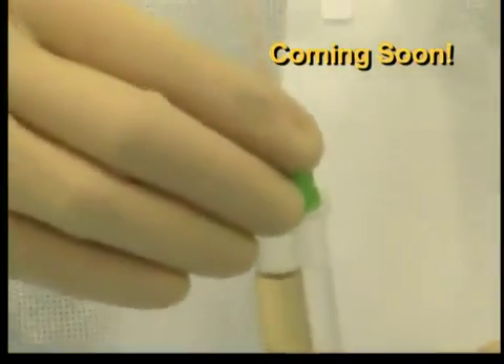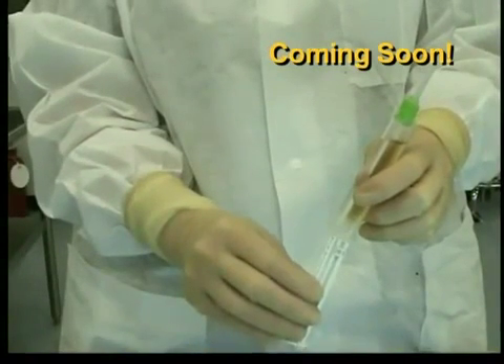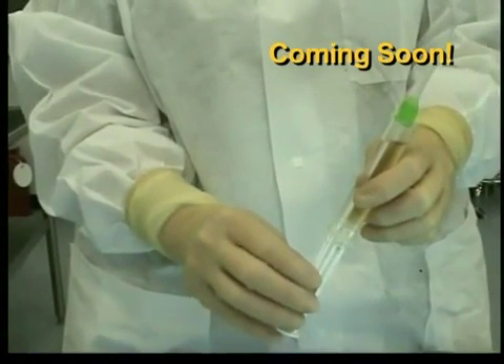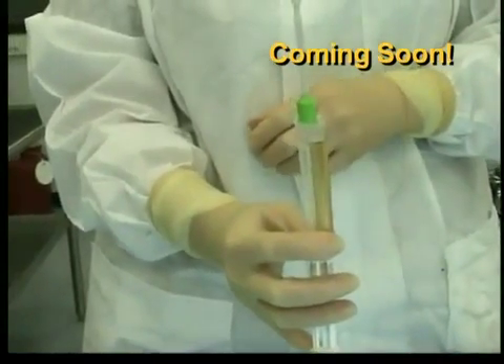Attach the spreader tip to the syringe and rotate the collar 90 degrees clockwise to lock the tip in place. While keeping the syringe upright, align the small and large barrels of the syringe with the corresponding syringe plunger heads and slide the plunger into the back of the syringe until resistance is felt.